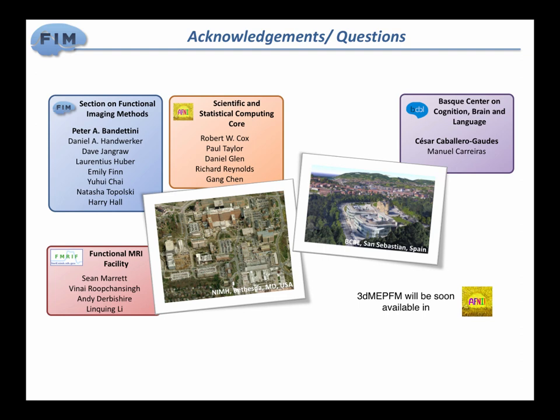Another question I have is about doing this run by run and how much data you really think one needs to collect in order to accurately run it. It's a hard question to answer. In my experience, I would argue that you want your time series to have at least 200 data points. Again, it depends on the TR and many things, but I've seen it failing to converge very often when my time series are less than 150. When my time series are longer than 200 data points, I see that issue happening less. But it's not a perfect number.